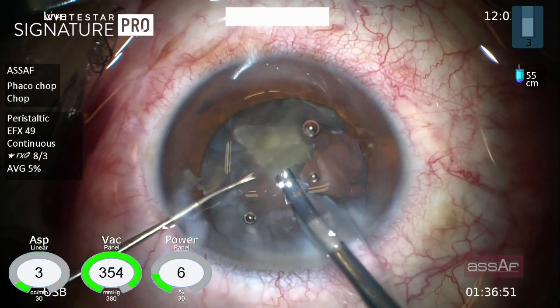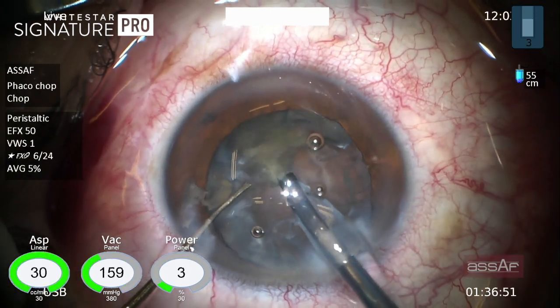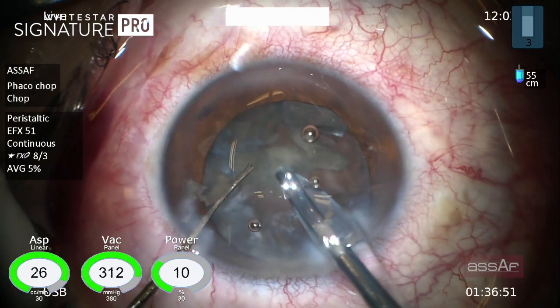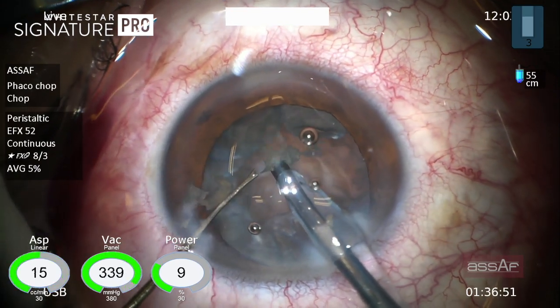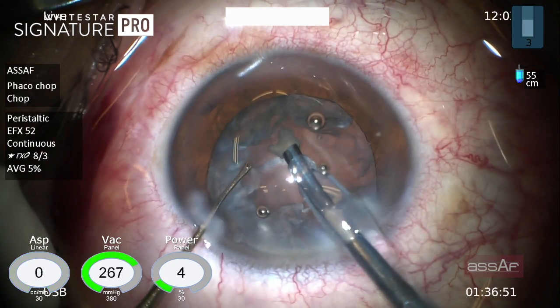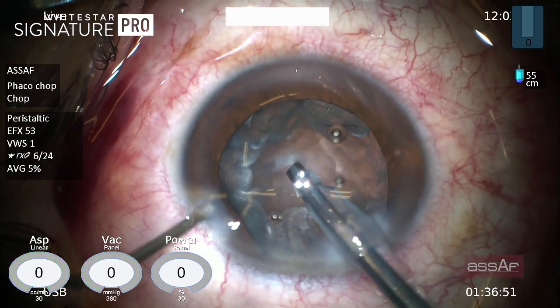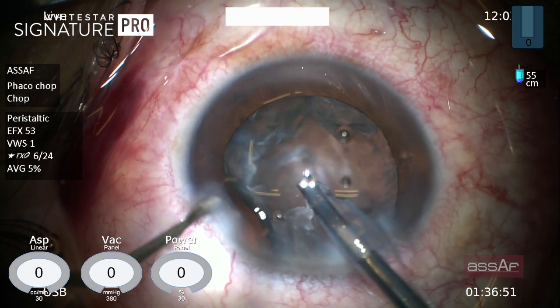Now this is the last quadrant, and you can see that the bottle height is at 55 centimeters and we have a reasonably stable anterior chamber. Remember to inject dispersive OVD before withdrawing the phaco tip outside the anterior chamber.